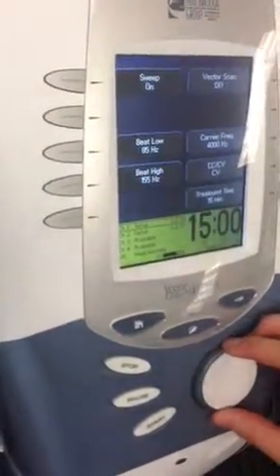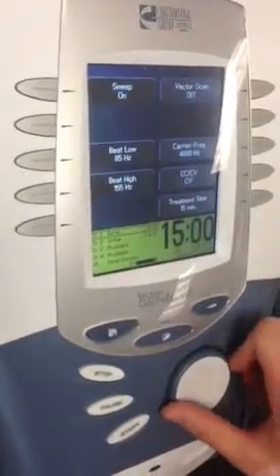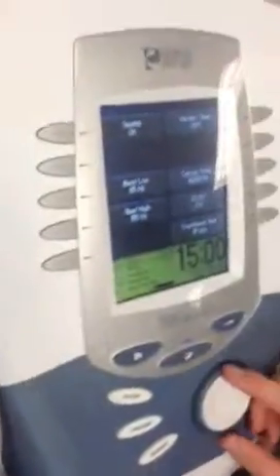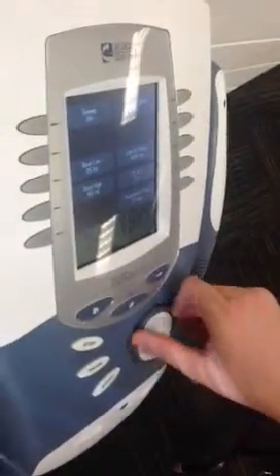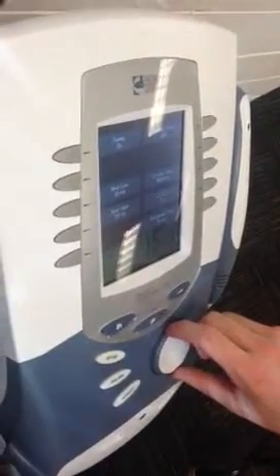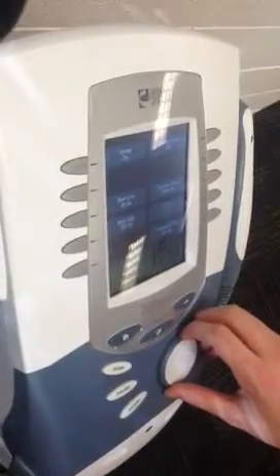Feel anything? Not yet. Yeah. Oh. Feel it. Bring it back down. Is that good? A little more. Up? Yeah. There? Yeah. I can feel that. Alright, then we hit start treatment time.